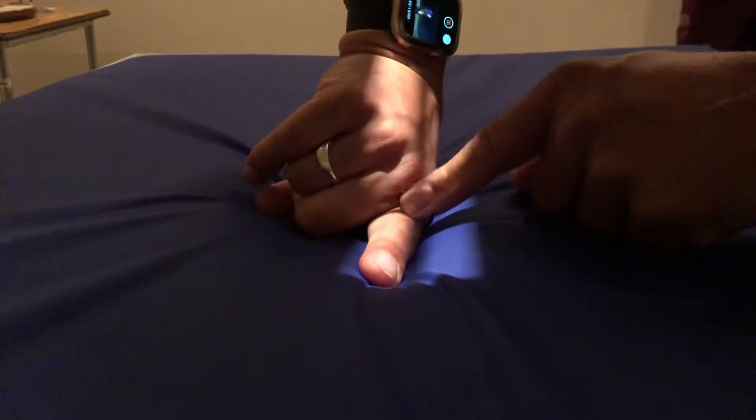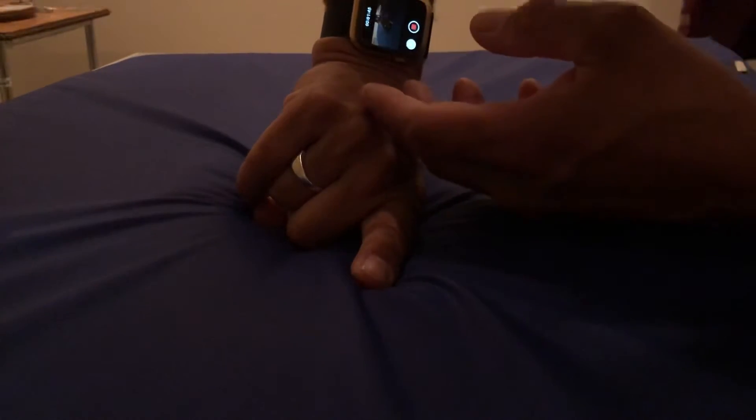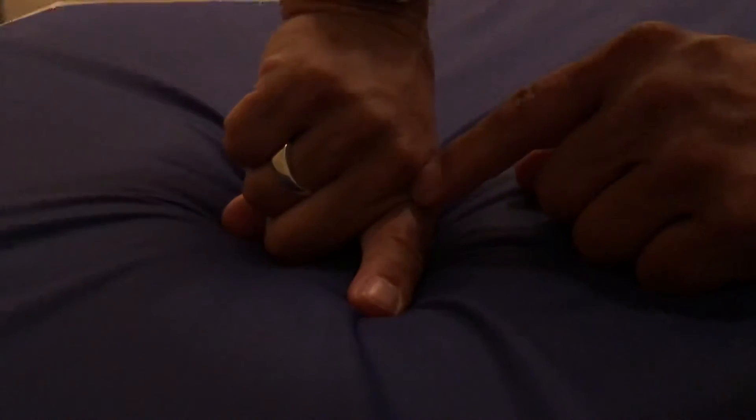The last one, which is the lateral, you can do it two ways. The first way is like this and the second way can be like this. If you are looking at the base of the finger to try to find a fracture, a lot of times what you can do is get the other knuckles out of the way by rolling the palm forward a little bit or rolling it back a little bit. When we turn the light on, we see all the knuckles coming down — every knuckle is getting superimposed on the knuckle that we want to see. So you can adjust the position, and it's not a true lateral, but it's close enough and it gives you a very good view of the index finger and the base of it.